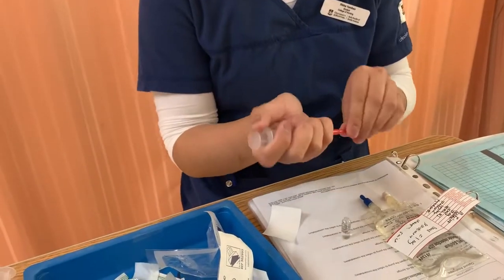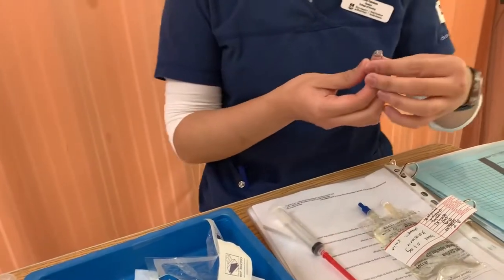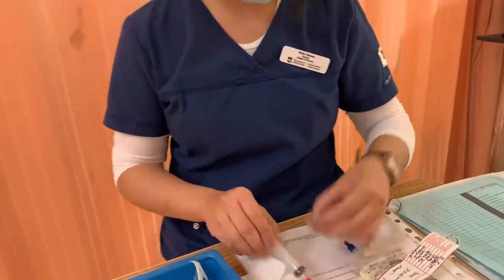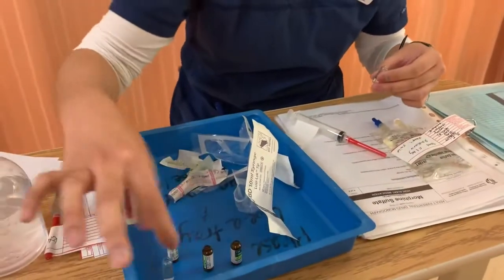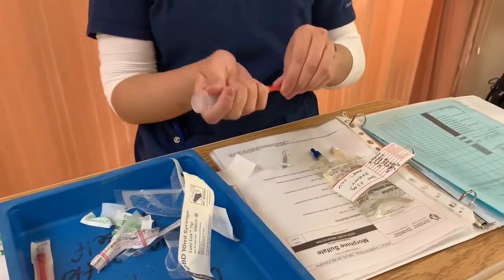Okay, so I washed my hands already. Prior to drawing up my medication, I made sure that each one of these is morphine at 10 milligrams per ml. So 10 milligrams per ml morphine, and so on for each vial. I also checked they're not expired as well. So I'm just gonna draw up my medication.